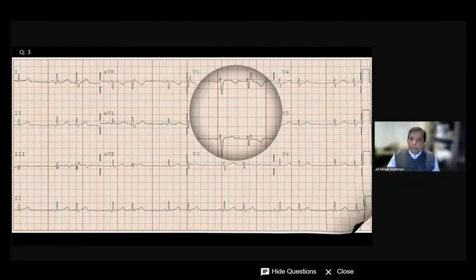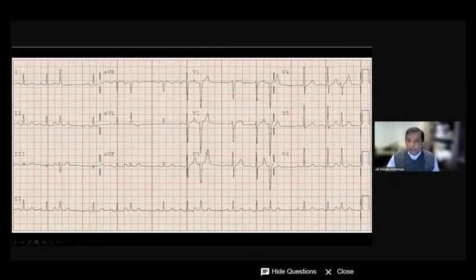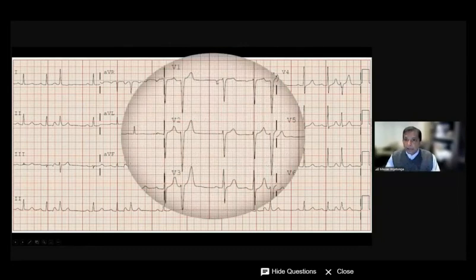So sometimes when this happens, in some patients, it's not the right bundle that aberrates. It's not the right bundle that is refractory. Like in this case, you have a normal P wave, and here there is another P hidden in the T wave. Now you may ask, I can't see the P wave. But if you go through all the leads, you can see, for example, here, this T wave looks different compared to that T wave. There's a sharpness here because, the way you extrapolate, there is a P wave hidden inside here. Because of this, this T looks different from that.